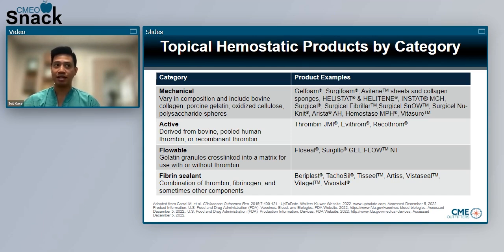So I've seen we've pulled out things like Surgicel Nu-Knit and the Fibrillar, to even things like FloSeal, like Dr. Dell mentioned, and also I've seen the use of Hemosorb, which I think acts a bit like a pencil. But ultimately the best thing as part of the surgical team is to communicate with the surgeon about what they would prefer to use for their hemostasis.